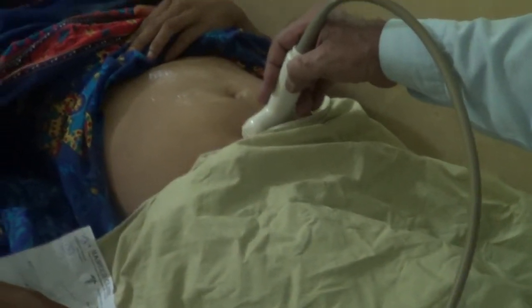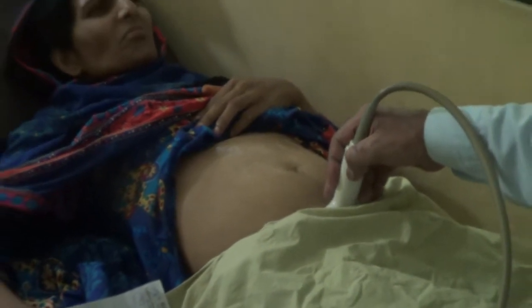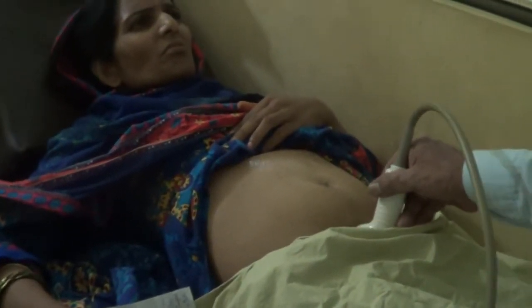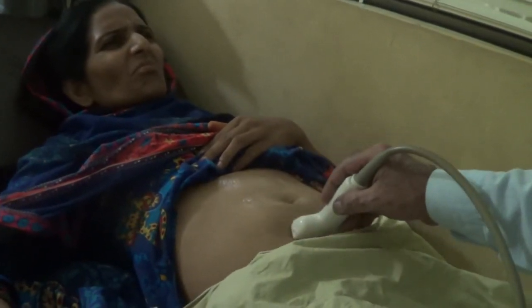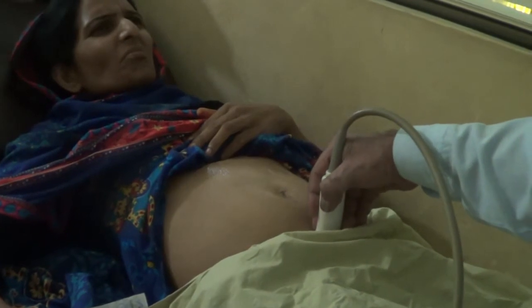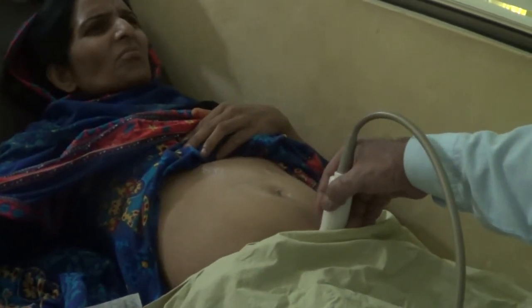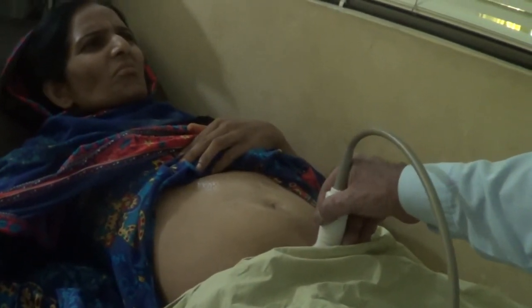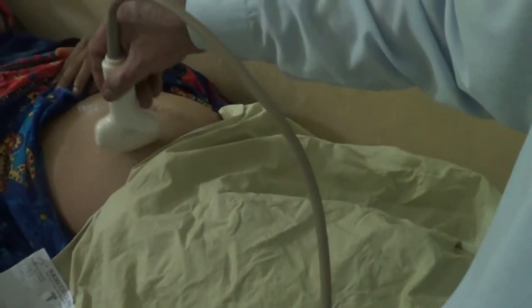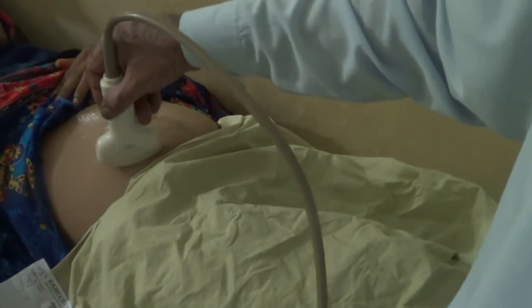This is the ultrasound of a 40-year-old female, married, who feels a mass or a swelling with pain in the right lower abdominal quadrant. She places her hand over here.